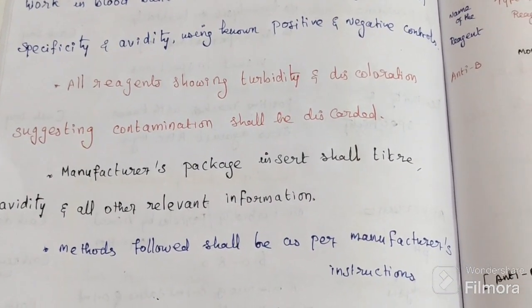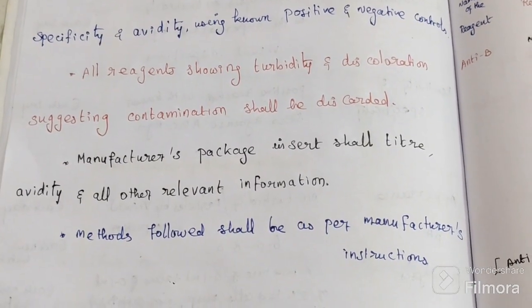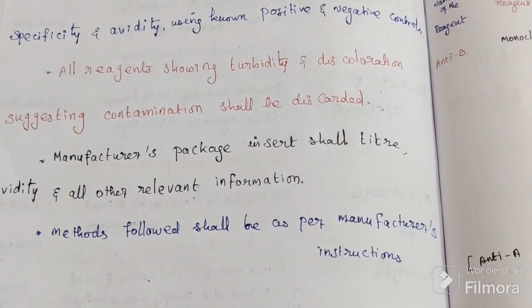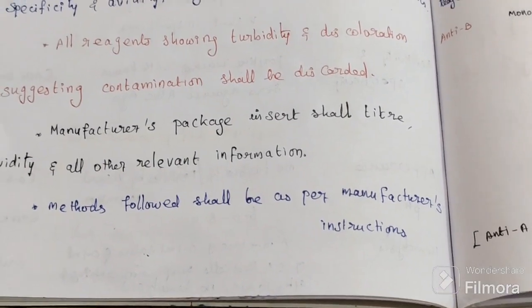Manufacturer's package insert gives titer, avidity, and all other relevant information. Methods follow manufacturer's instructions.